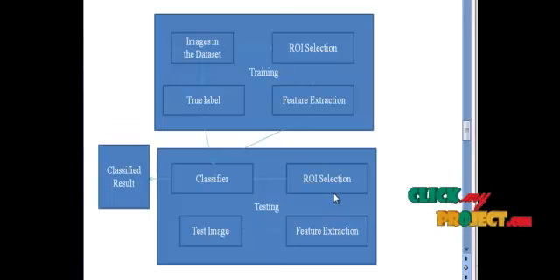Then the region of interest was chosen from the input image using likelihood binarization. It is done based on threshold segmentation. Regions within the threshold were grouped as a single region, and the regions that are different from the threshold are grouped into another region. They were separated by applying specific colors or by replacing the colors with the original pixels in the image.